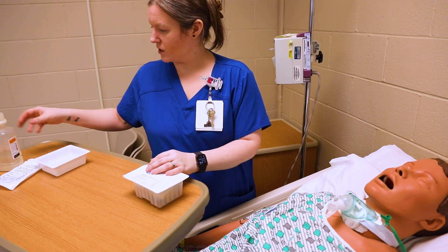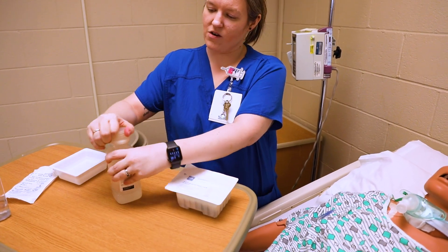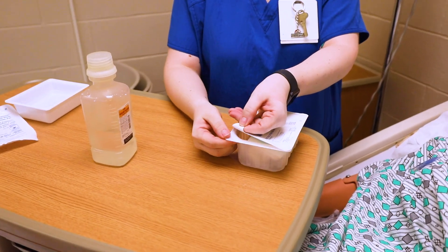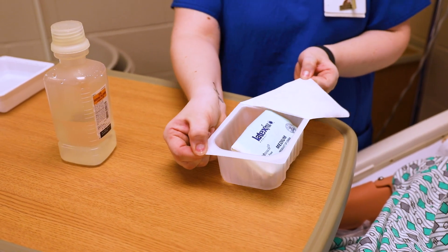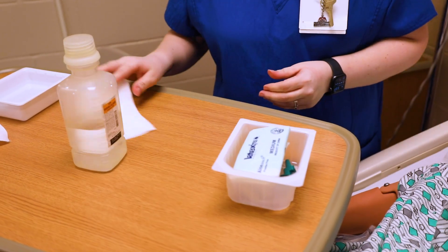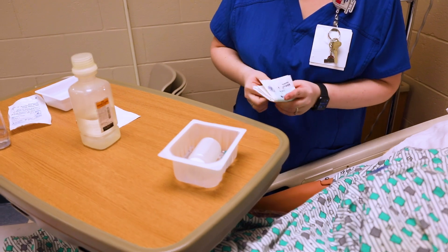I've got my sterile saline here — make sure that it's nice and sterile. I'm going to loosen up the cap and open up my kit. We're going down into the lung, so it needs to be sterile. I always tell everyone: open sterile kits as if they're an alligator, so you want to open them away from you.